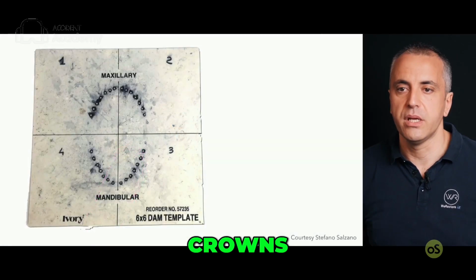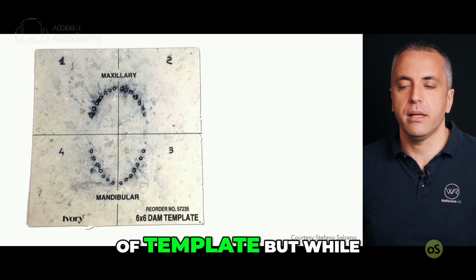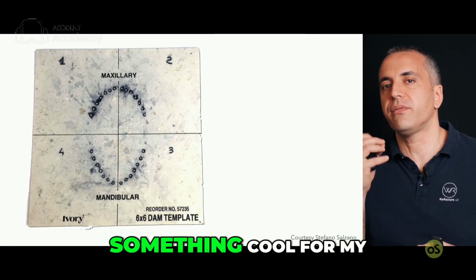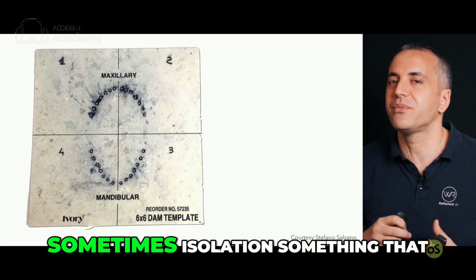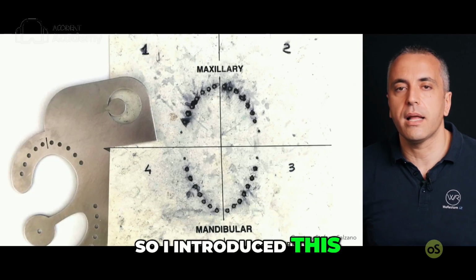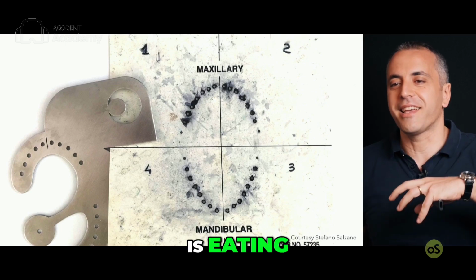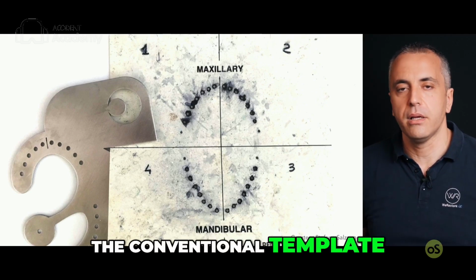So we have this kind of template, but while I am a teacher of restorative dentistry, I wanted to introduce something cool for my students, because students consider sometimes isolation something that is difficult and boring and not very nice. So I introduced this strange animal which is called the Pectum, that is eating, it is just a joke of course, the conventional template. Why the Pectum?